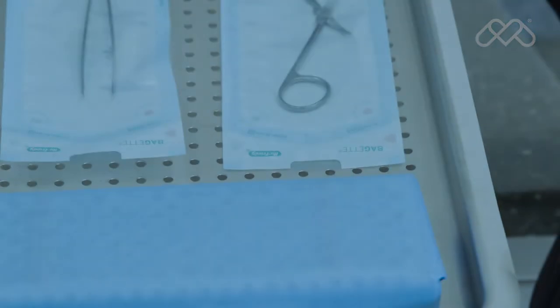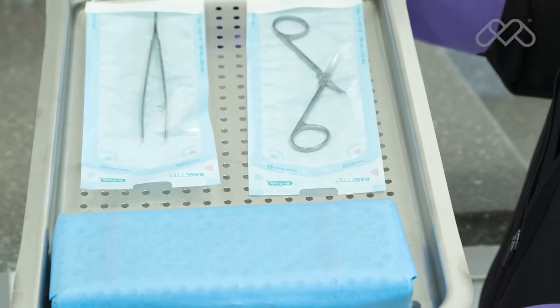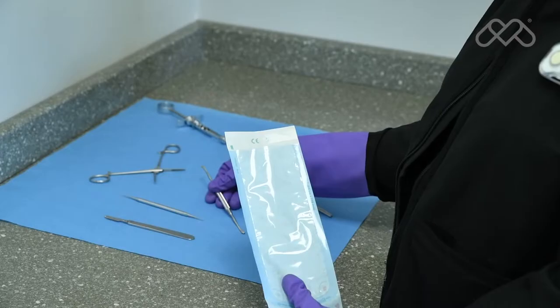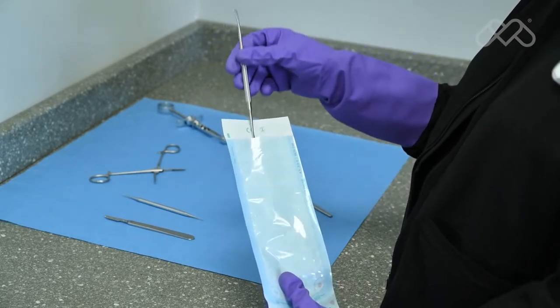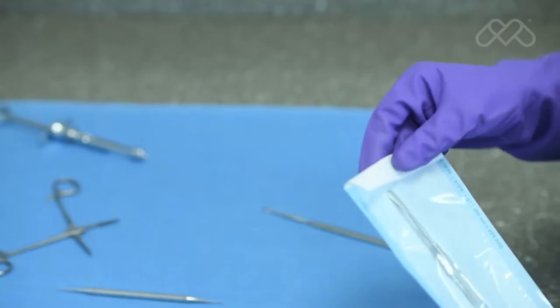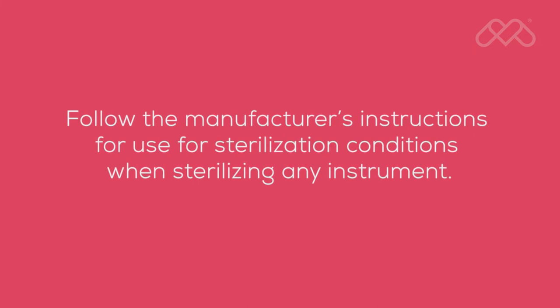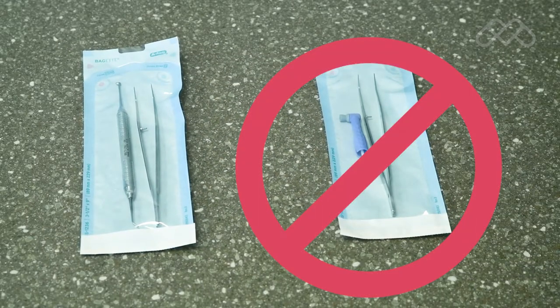M9 and M11 steam sterilizers are capable of sterilizing pouched or wrapped items to preserve sterility after processing. When pouching or wrapping items, use only sterilization pouches and wraps that have been cleared by the FDA and labeled for use with the steam sterilization cycle being used. Follow the manufacturer's instructions for use for sterilization conditions when sterilizing any instrument. Instruments made from different materials should not be mixed in the same pouch or wrapped pack to avoid potential instrument damage.